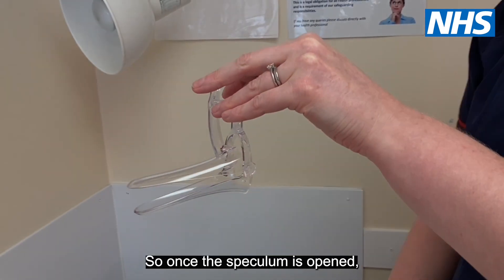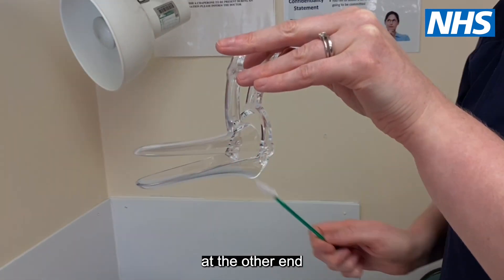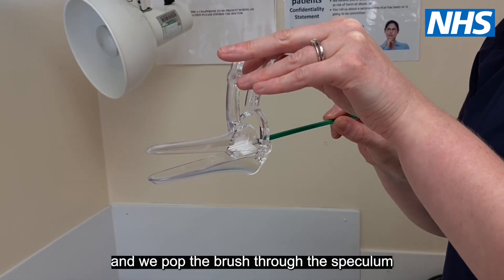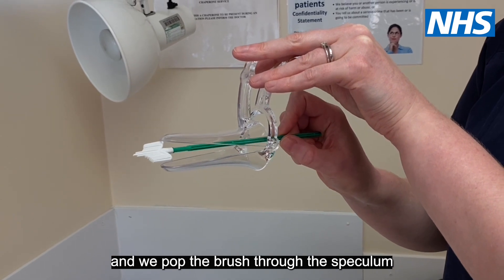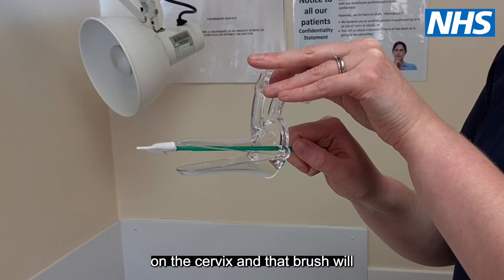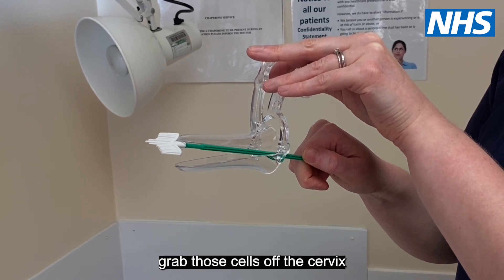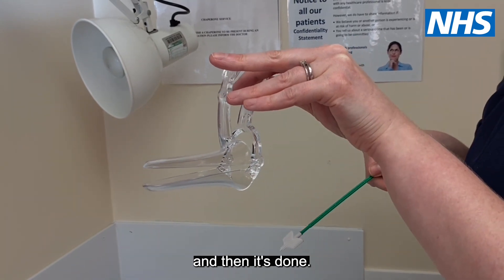Once the speculum is opened, we can visualise the cervix at the other end. We pop the brush through the speculum and just rotate it gently on the cervix, and that brush will grab those cells off the cervix — and then it's done.